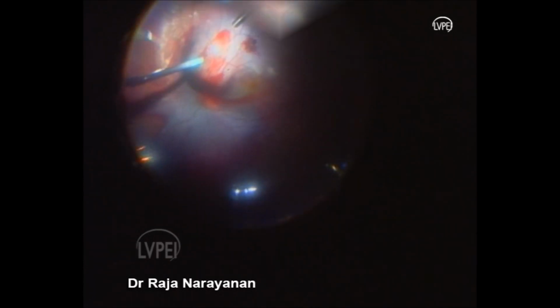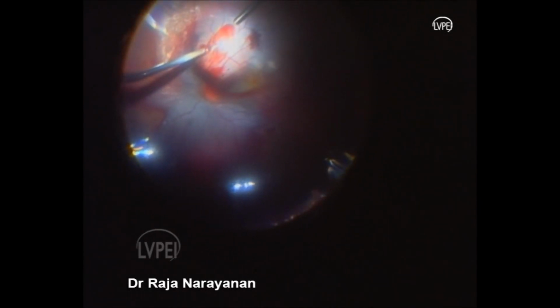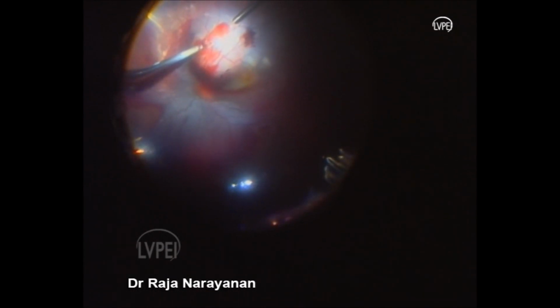After aspiration of the blood, there was a large clot present in the superotemporal quadrant, which was manually mobilized with the soft tip to the retinotomy site. Hence, with the help of the cutter, the clot was aspirated. Laser was done at the retinotomy site and silicone oil was injected.